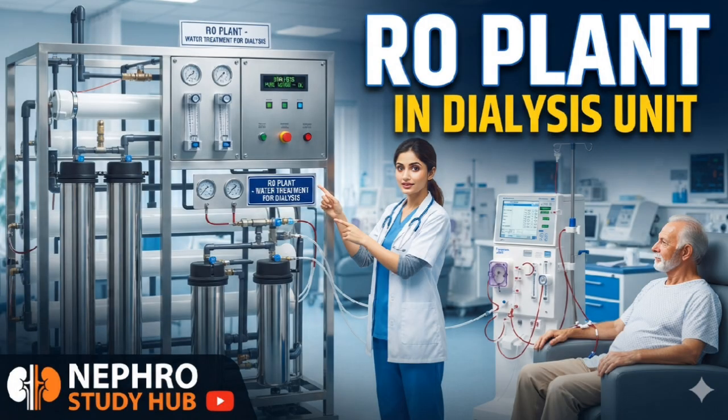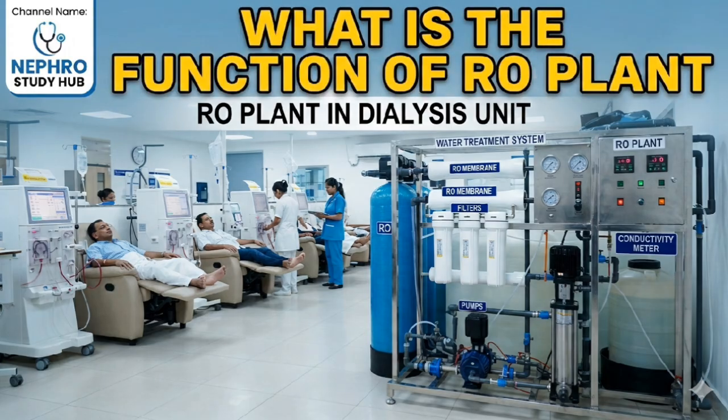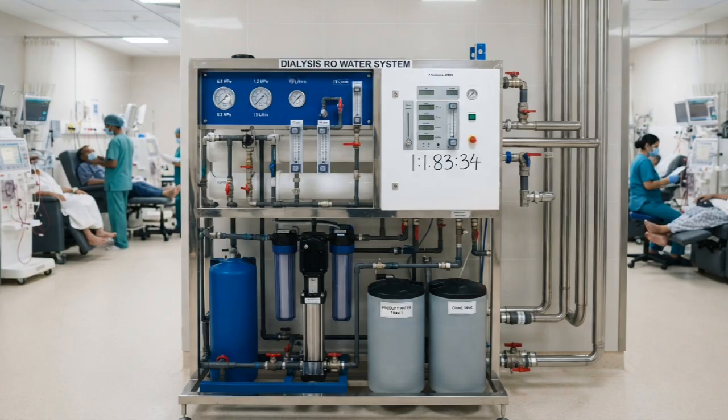Today we are going to know about our RO plant. What is an RO plant and what is its function? How does it purify our water for the dialysis treatment? Basically, we know that RO water is needed for hemodialysis.